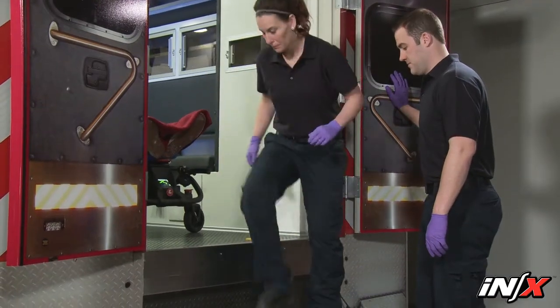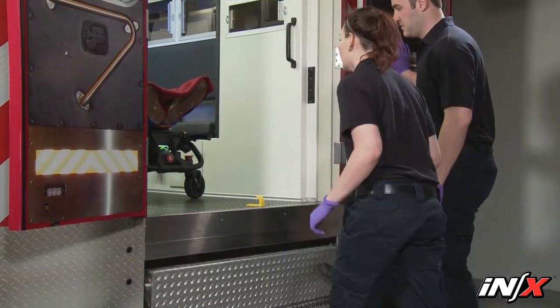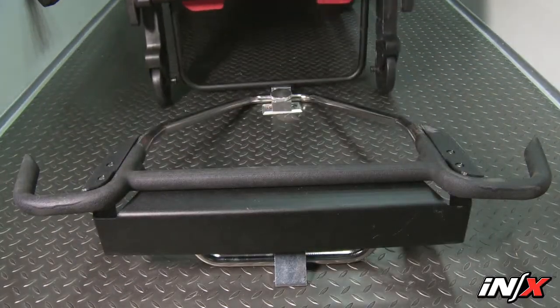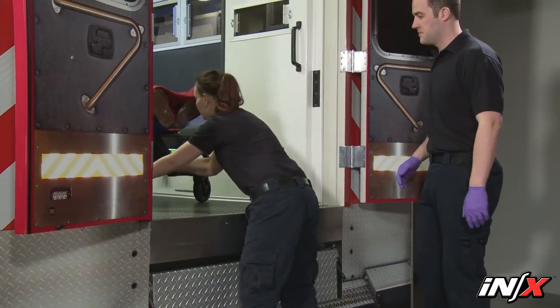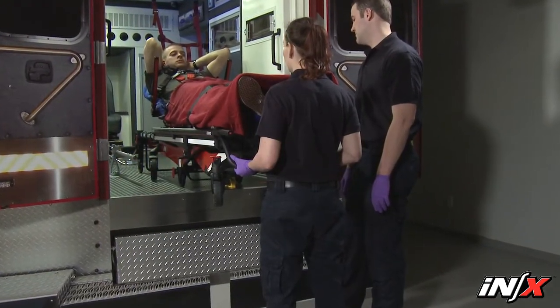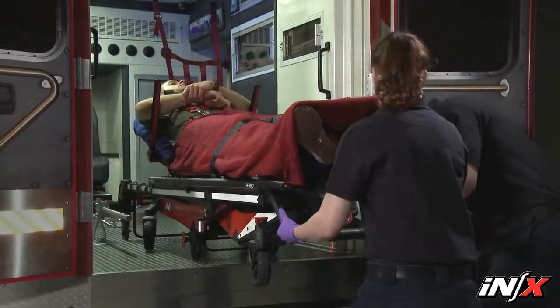Before unloading the NX from the ambulance, raise the folding ambulance bumper if present. Release the NX from the fastening system and begin pulling it from the ambulance with both hands. Keep the NX level with the floor and parallel with the ambulance sidewalls as you roll it out of the ambulance.